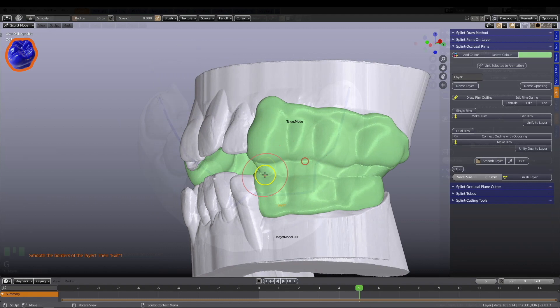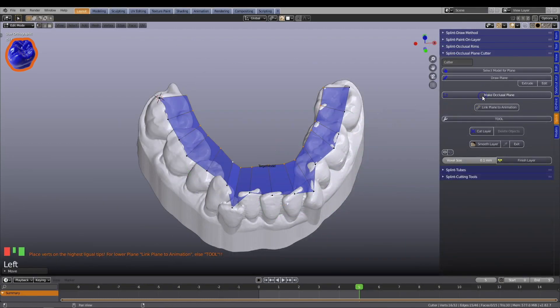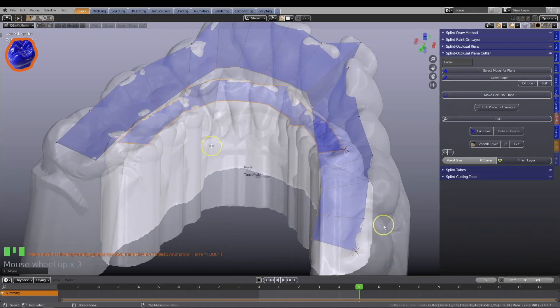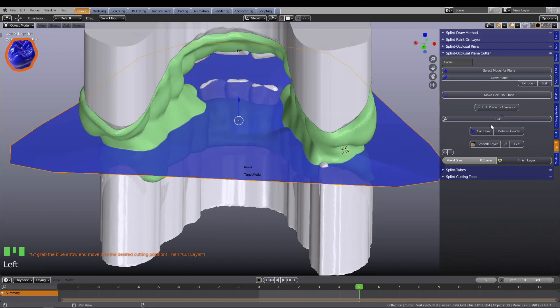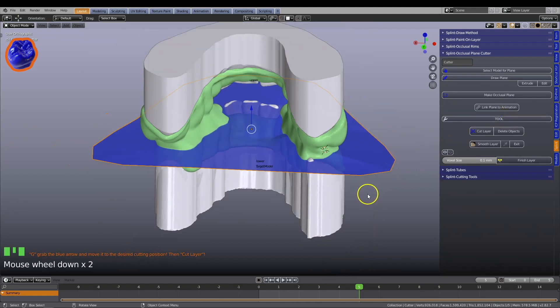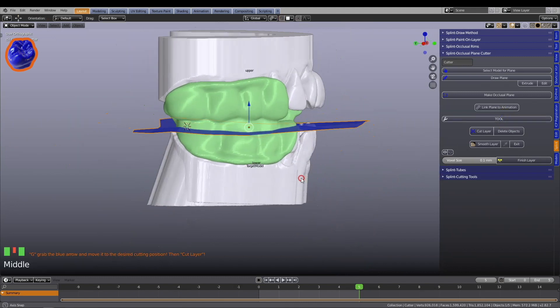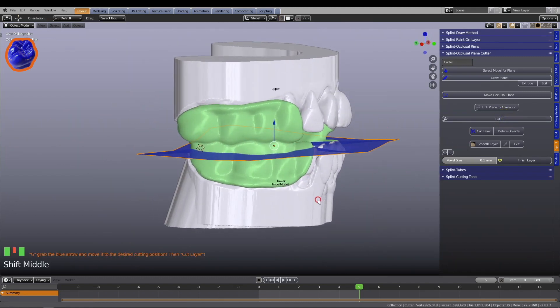Immerse yourself in Blender's amazing visual effects while designing your dental work. The dual splints are easily separated by using the occlusal cutting tool.